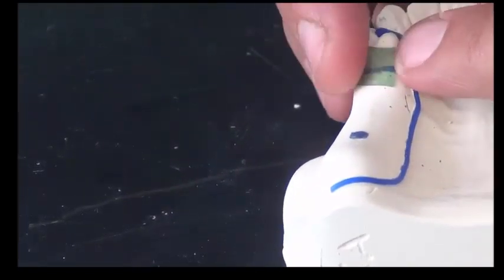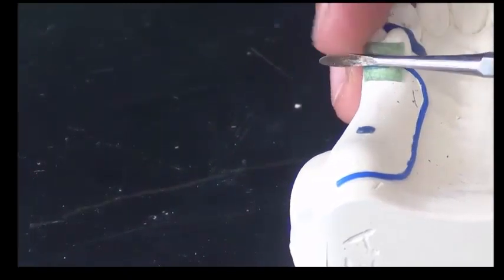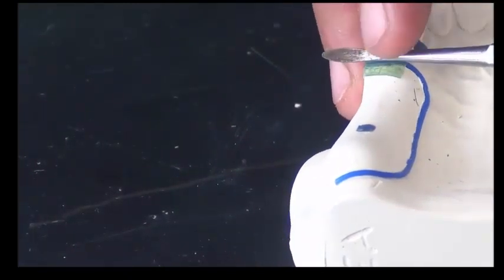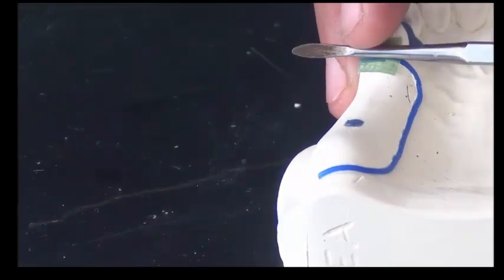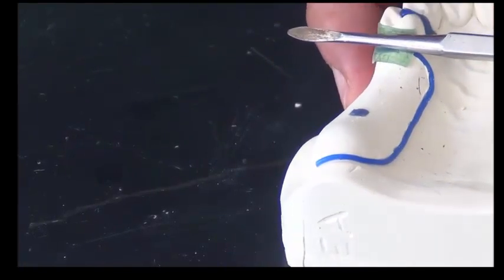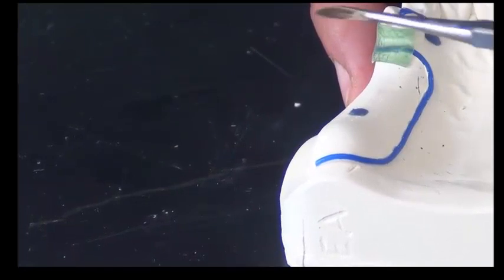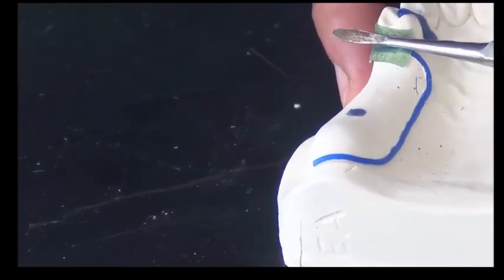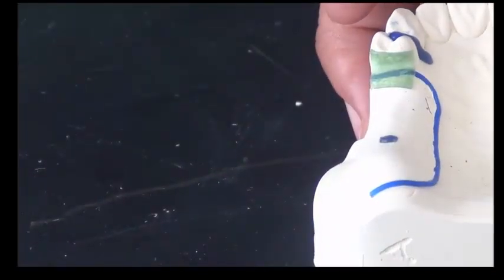We're adapting it buccally and lingually, where I'm using the corner of the instrument to make sure it's filling in the angle. Because if I did not do this movement and it's like flowing over the surface, what will actually happen is that I'll not have space here to place my second tooth. So I want the metal clearly adapted to the corner, but I'm sure that it will not go to any undercut because these undercuts were blocked previously.